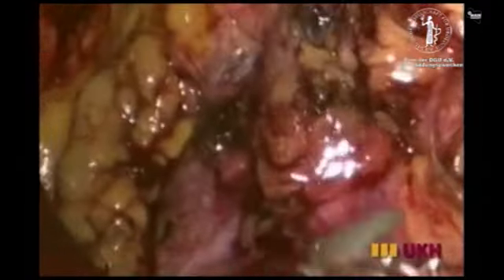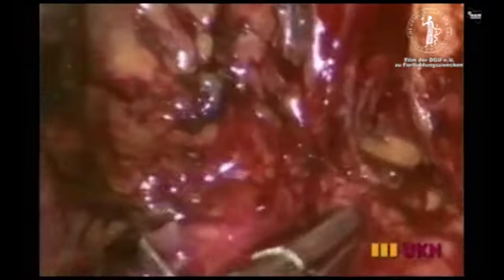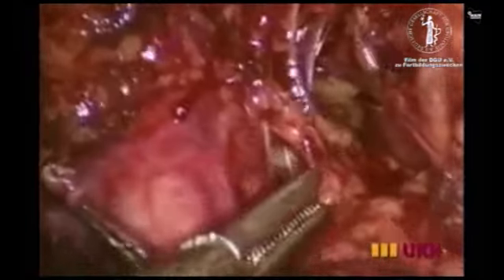The spermatic vein is clipped and cut. The lower pole is lifted laterally and the hilum is placed under gentle tension in order to prepare the vessels. The renal vein and the renal artery are identified. The lymphatic vessels are sealed using a laparoscopic ligature system.